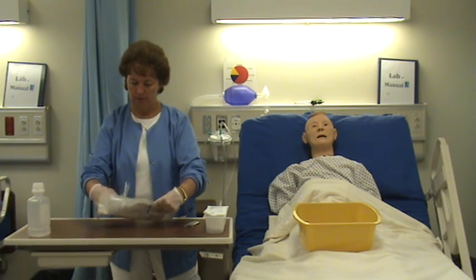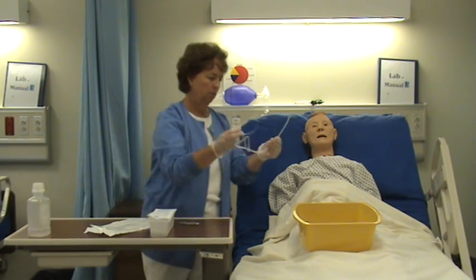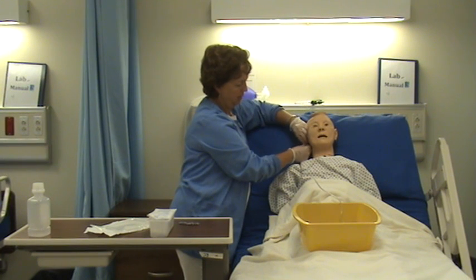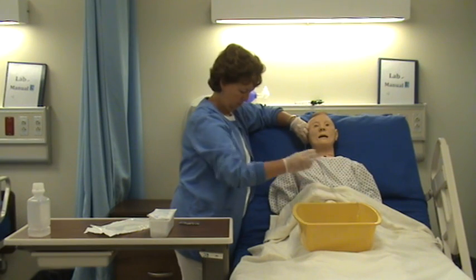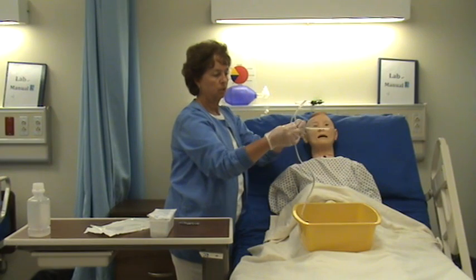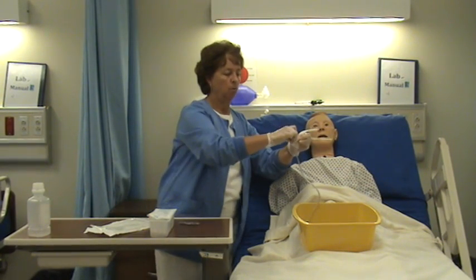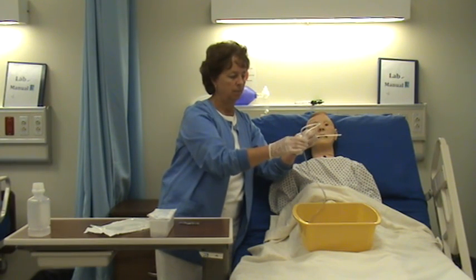I'm going to open up my NG tube and measure. I want to measure from the tip of his nose to the tip of the ear, and then down to the xiphoid process at the end of the sternum. The tube has markings on it, but I prefer to put a small piece of tape to mark where I need to insert to, because that helps me remember which mark I was at.